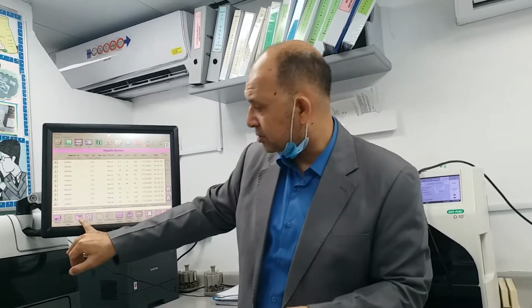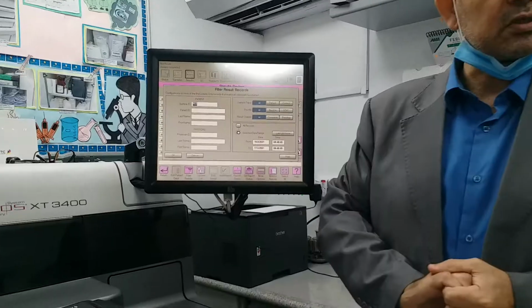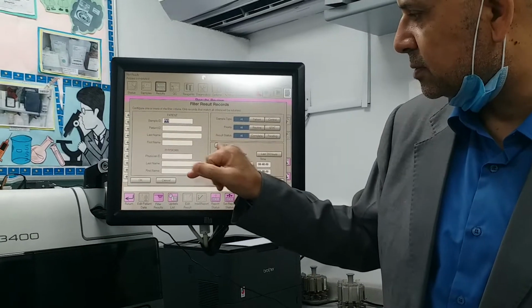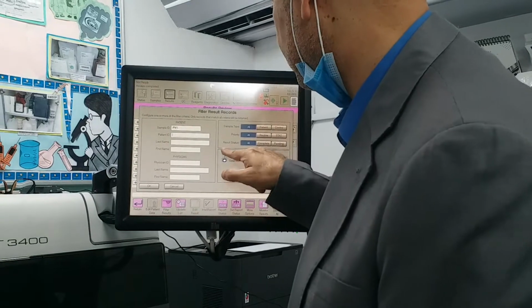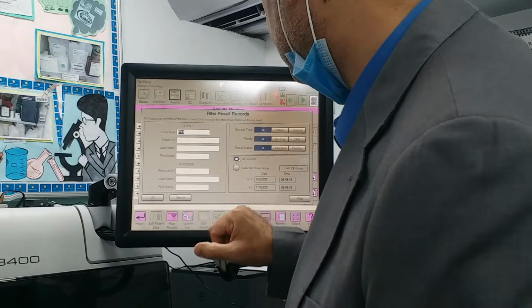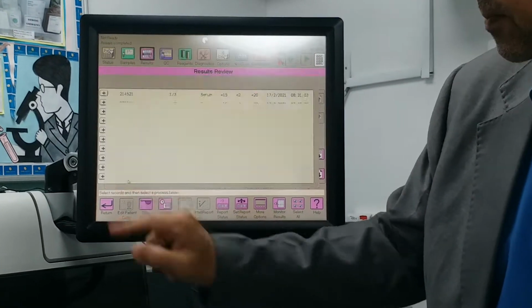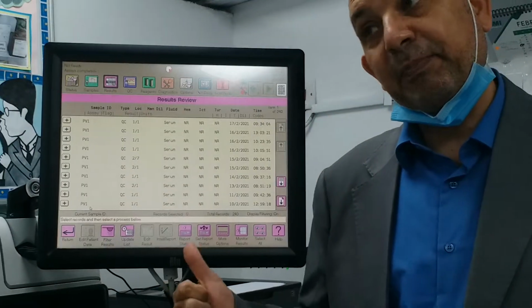So for that, how do I print it? I just go to result. I enter by filter. Enter the data which you want, and just say okay here. Suppose this is all records. But I have this in ECIQ as well. Can we try one patient, sir? Okay, I use all records and I just say okay. Like that. Now, can I print it all on one paper?